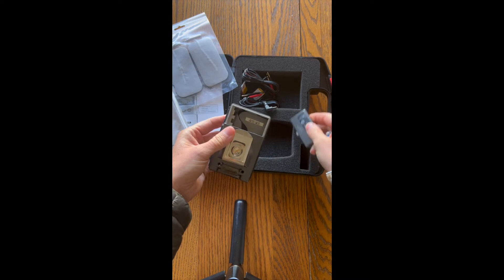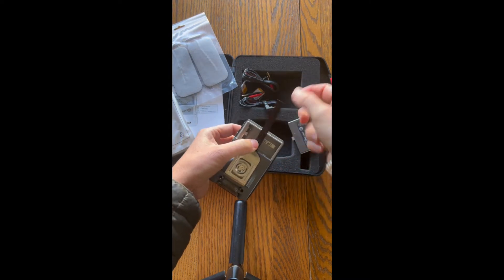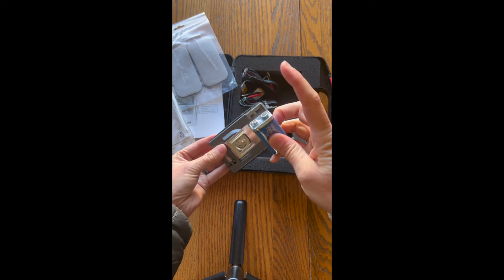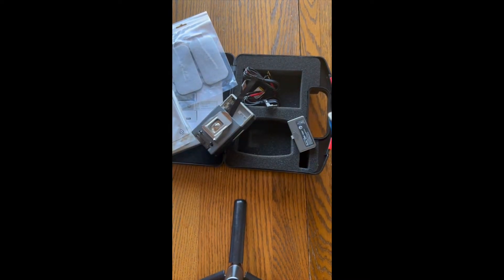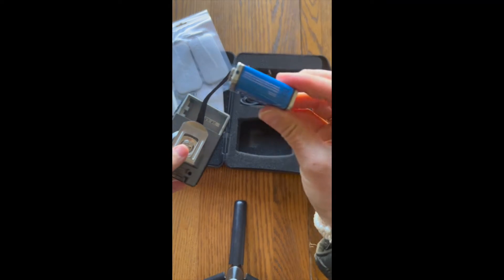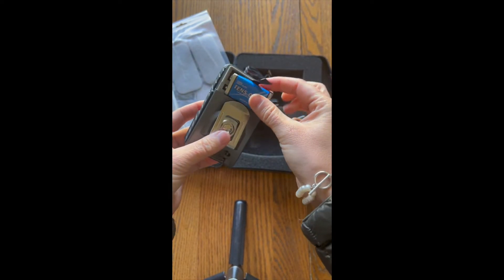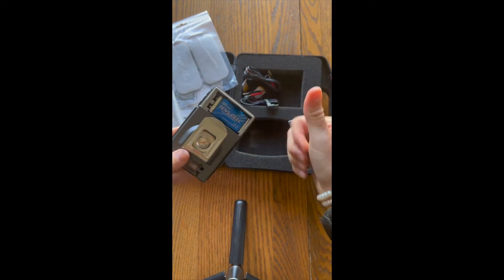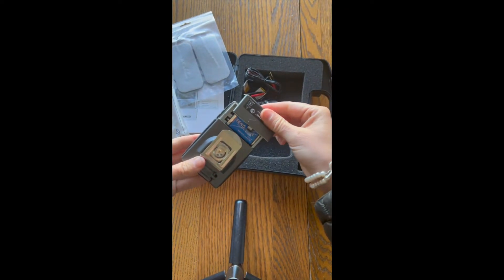Typically the units will come with a 9-volt battery that is often covered in plastic, so you'll have to unwrap that. When it is unwrapped, you can go ahead and place it into the TENS unit, and then return the cover to the bottom of the TENS unit.